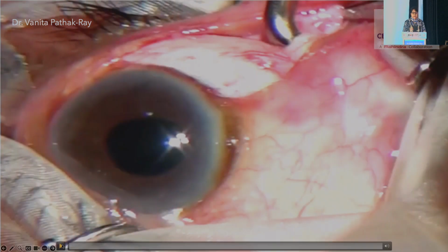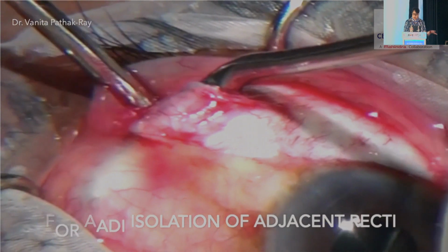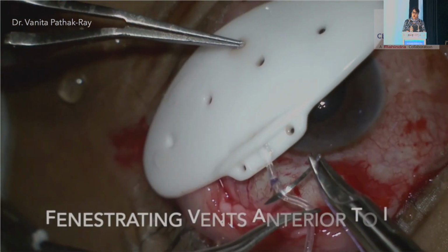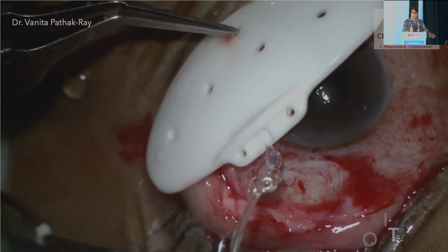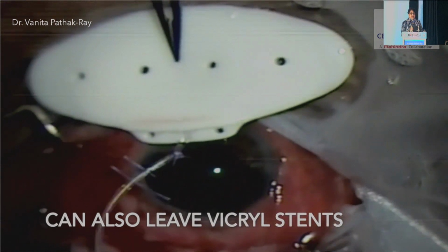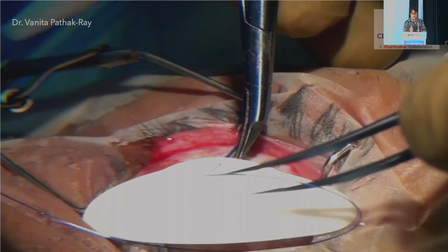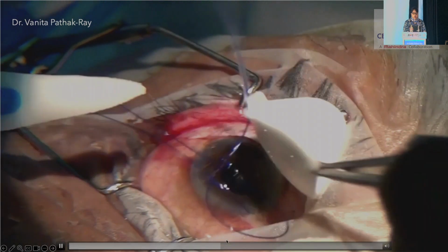There will be more in the next IC, but you have to clear off the muscles. You have to isolate them. You have to clean underneath them. And I prepare the plate a priori. I first check patency, then I occlude with a ligature, and then check occlusion. Following this, I make fenestrations in front of it and check that it is actually draining in front of the occlusive ligature. You can also leave a Vicryl stent, as you can see there, and you can check the drainage again. What you can also do is reduce the size of the lumen by placing a 4-0 Prolene inside the tube lumen. And after that, you carry on with your usual plate preparation.